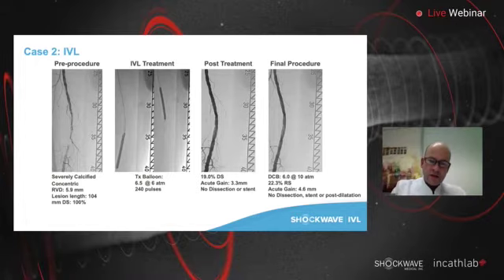So this was taken from the study, and we didn't take all the images. There was a third balloon used in between. That was out of the study, not at our site, actually from another site, but all balloons had to be stored for the core lab analysis. And this is something we have to do: we have to overlap the balloons, and also if we inflate the balloons and do the pulses, we very often do the procedure not only once but a second time or something like that.